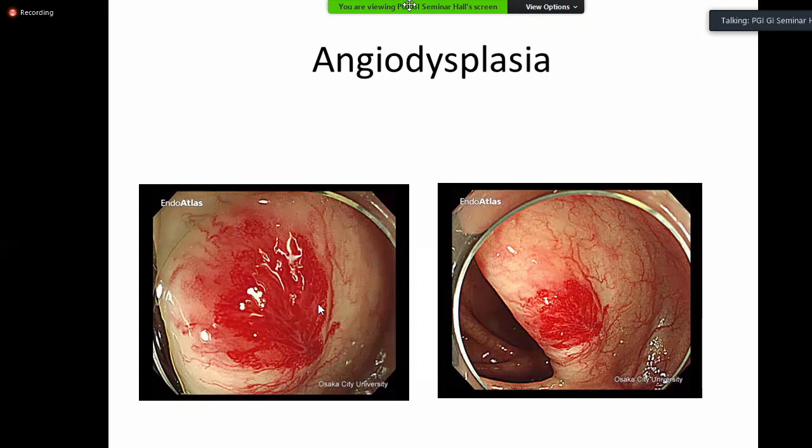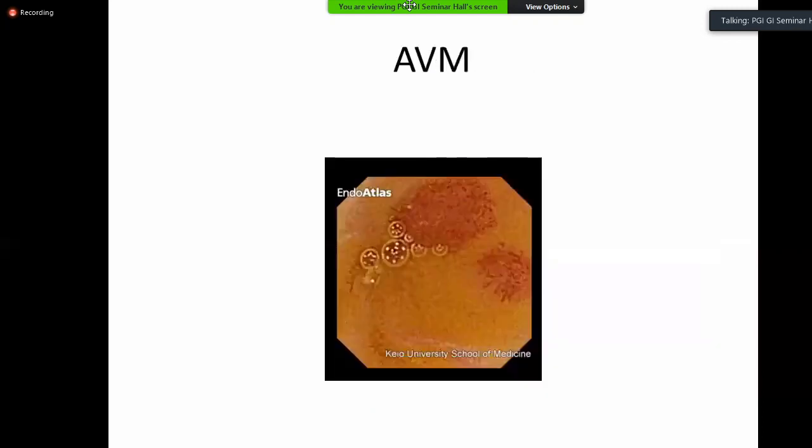So you describe this lesion as a vascular lesion which is rounded with vessels proliferating and going into the periphery up to a distance of about 2 centimeters from the central point. So the size, the shape, and the location of this vascular lesion, whether actively bleeding or not.